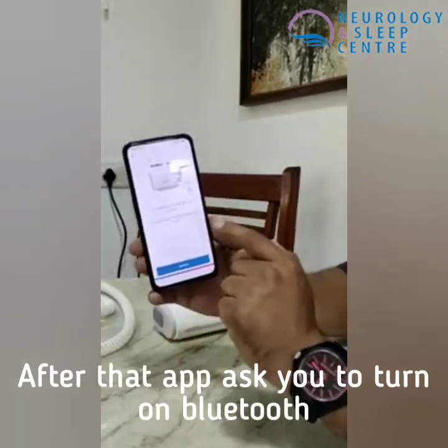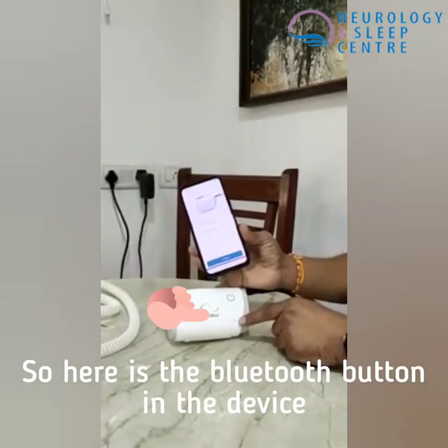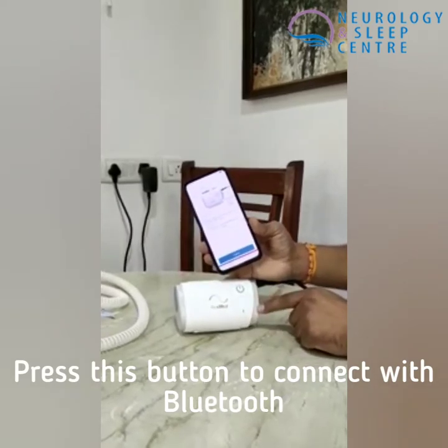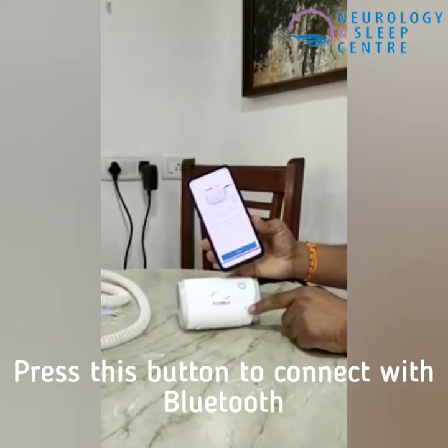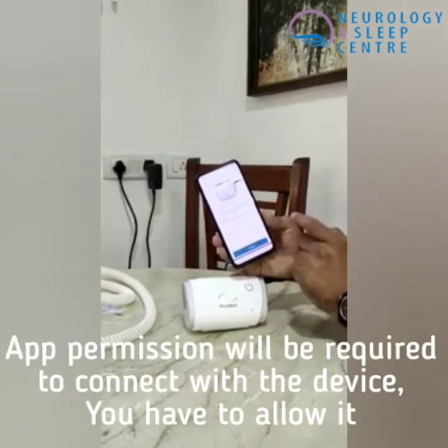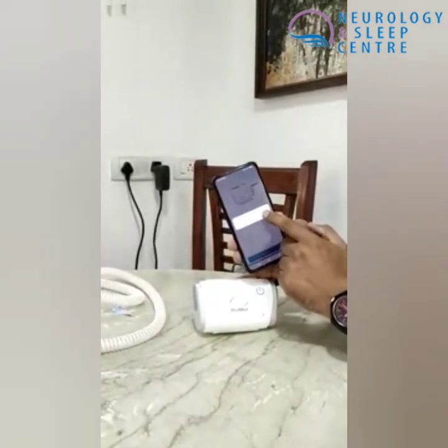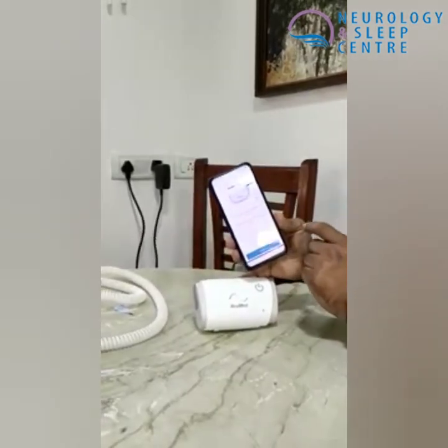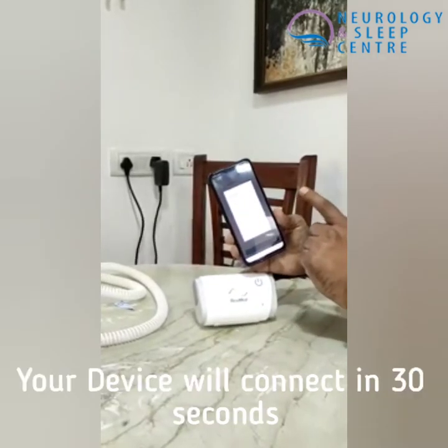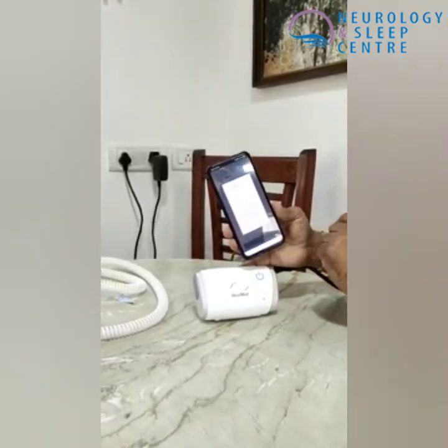Now the app is asking to start the Bluetooth. There is a Bluetooth option in the device. I press it and now Bluetooth is connected. The app is asking about Bluetooth — I've just allowed it. Now Bluetooth is connected.